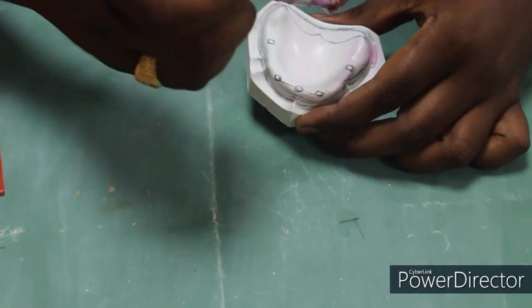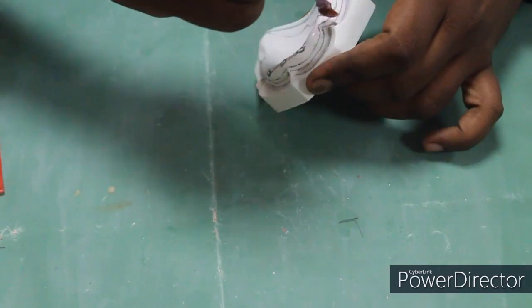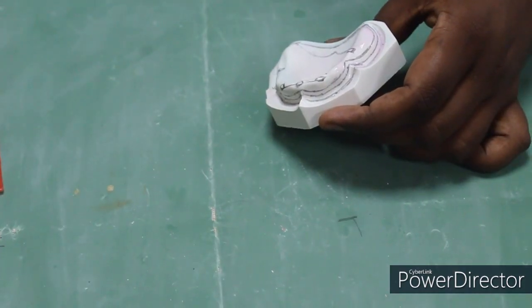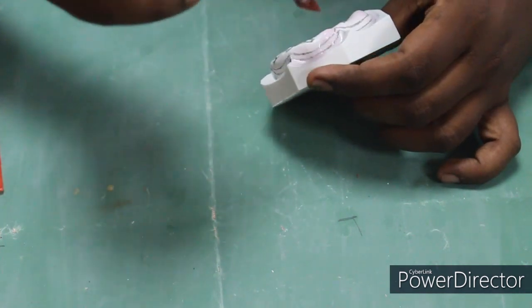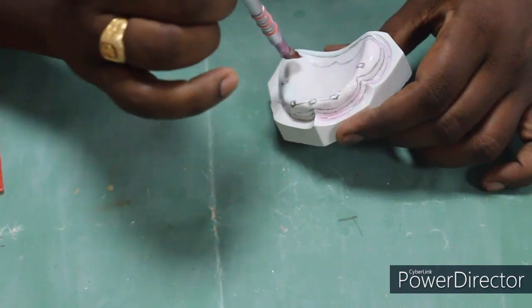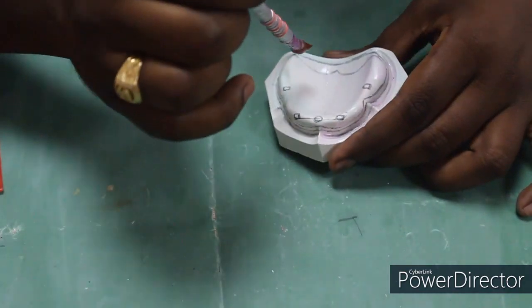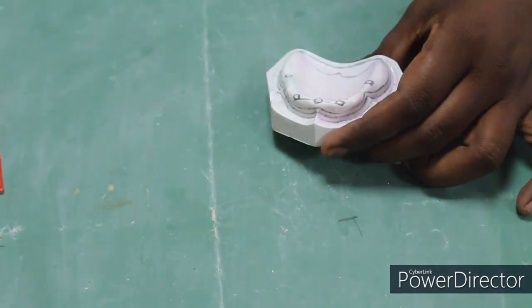Now in this video we are going to see the application of cold mold seal on the primary cast before making the custom tray. It is advised to apply this cold mold seal in a unidirectional way to prevent removal of the first applied layer. The mechanism behind this cold mold seal is a sodium alginate composition.